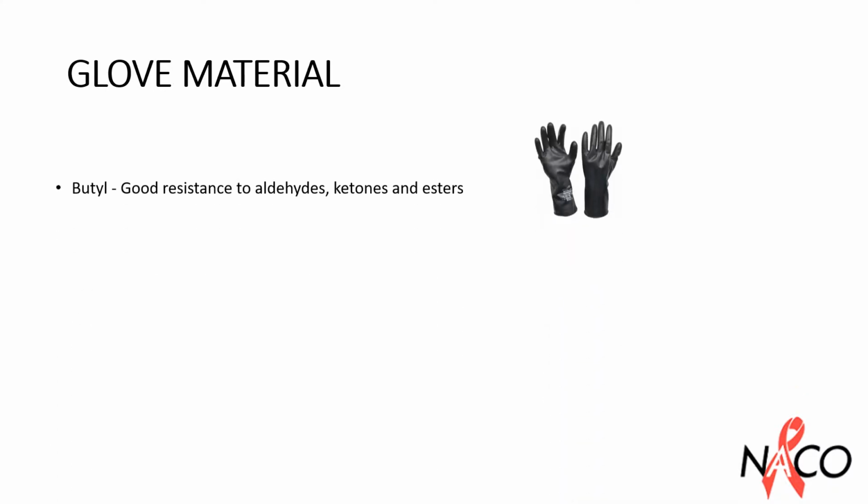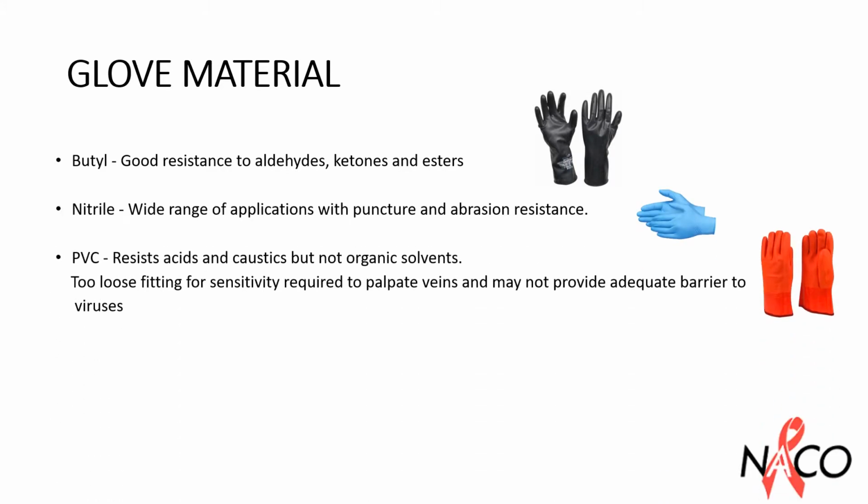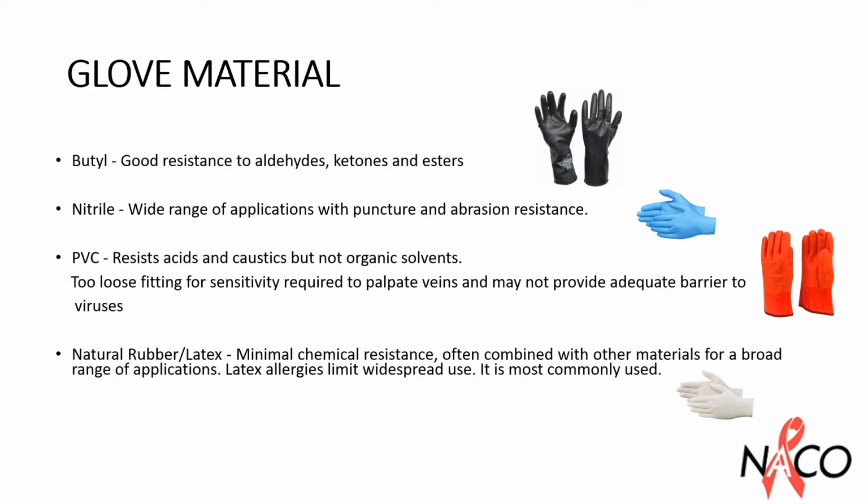Gloves can be made of butyl, nitrile, polyvinyl chloride, or natural rubber or latex. Butyl material provides good resistance to aldehydes, ketones, and esters. Nitrile material provides wide range of applications with puncture and abrasion resistance. Polyvinyl chloride resists acids and caustics but not organic solvents. They are too loose fitting for sensitivity required to palpate veins and may not provide adequate barrier to viruses. Natural rubber, latex, minimum chemical resistance, often combined with other materials for a broad range of applications. Latex allergies limit widespread use, it is most commonly used otherwise.